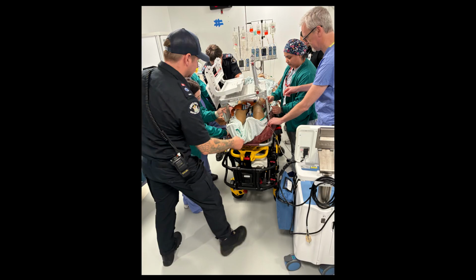Ensure that the IAB tubing is on the outside of the pack rack. If you do not do this, you will not have enough slack when inside the ambulance to secure the IABP. Consider wrapping the patient so that you can easily move blankets to view the IABP insertion site.